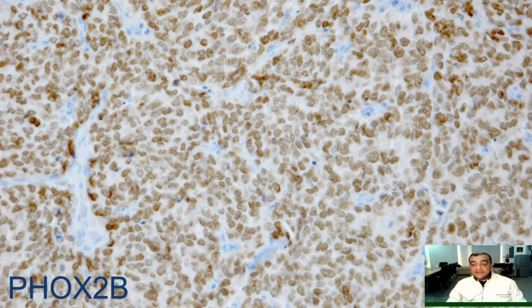I found it very helpful, and it really very nicely highlights the ganglionic cells in Hirschsprung disease. So let's come back to our neuroblastoma case. Here we can see very nice intensive nuclear staining of PHOX2B. This is just enough with the histologic picture to show that we deal with neuroblastic cells and neuroblastoma.